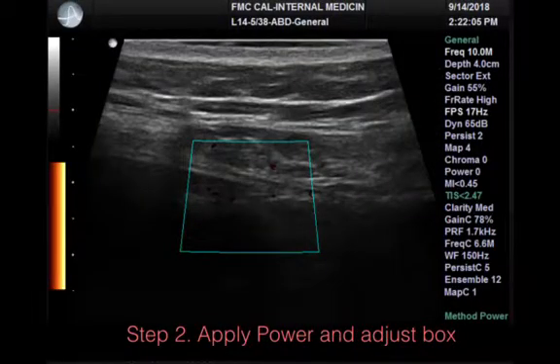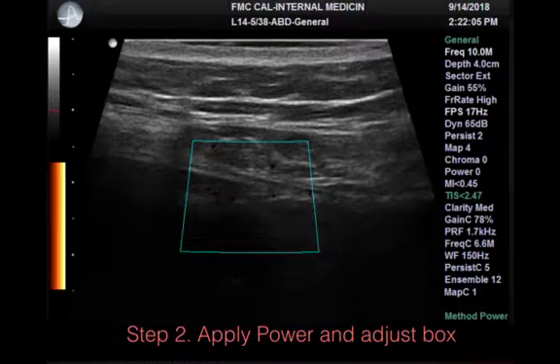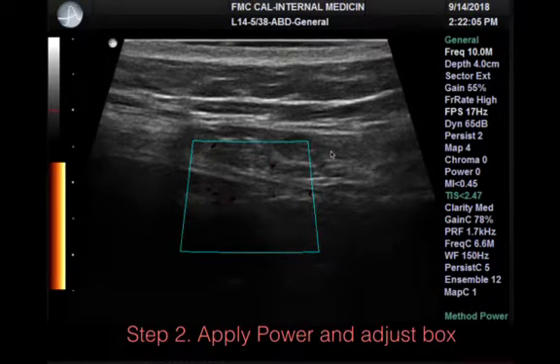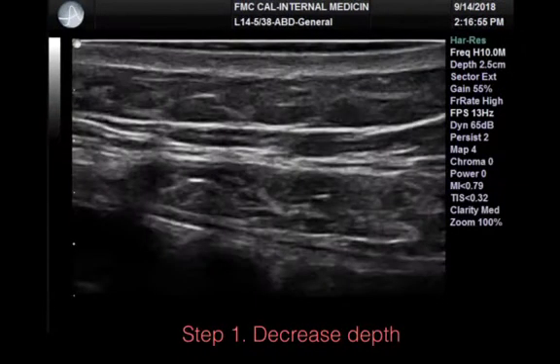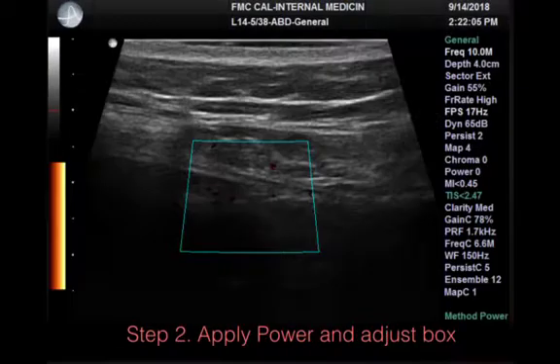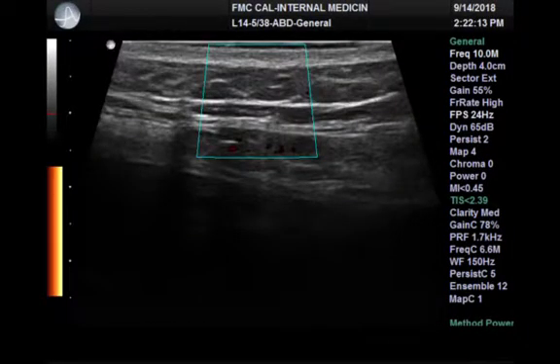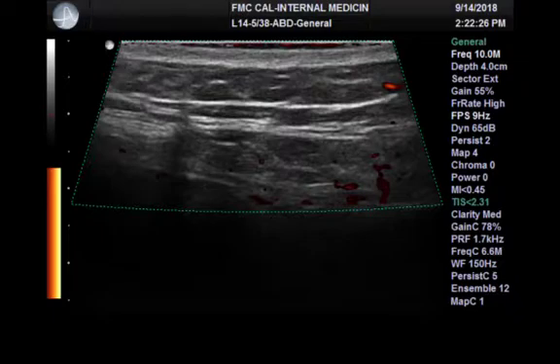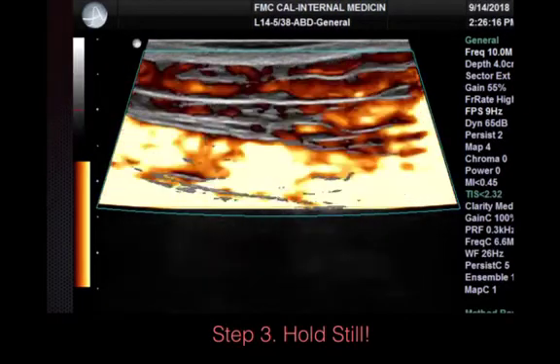Once you've done that, you're going to turn on Power Doppler, and invariably you'll have to move the box because it's never where you need it to be. In this case it's a little too low — I'm only seeing part of the abdominal wall — so I need to move it up. I would also want to increase the size of the box so that it captures the entire area I'm interested in.